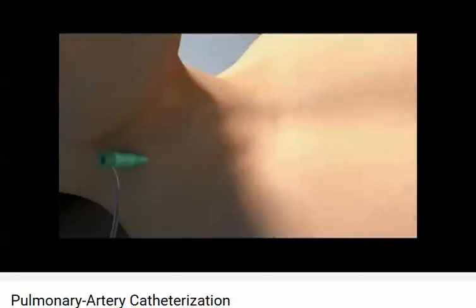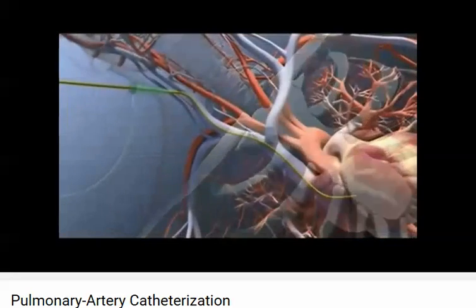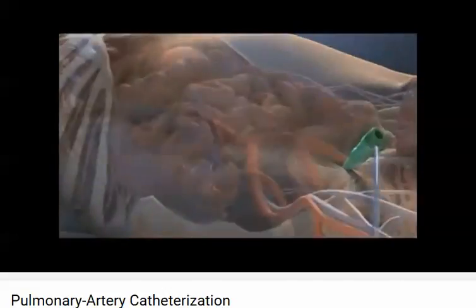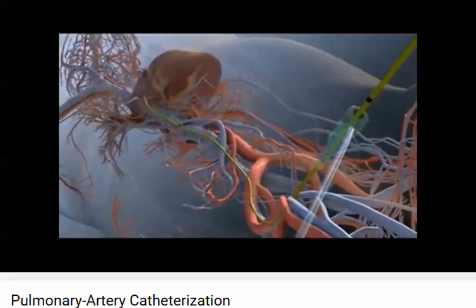The right internal jugular vein and the left subclavian vein are ideal sites because the curvature of the pulmonary artery catheter facilitates passage through the heart. Advancing the catheter from the left internal jugular vein, right subclavian vein, or femoral vein as shown here can be more challenging and often requires fluoroscopic guidance.